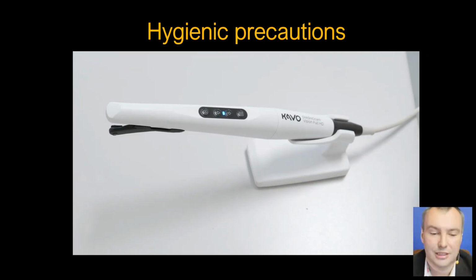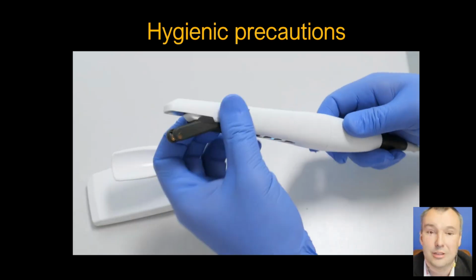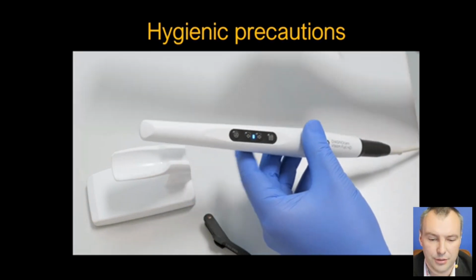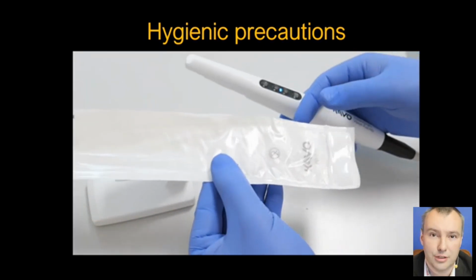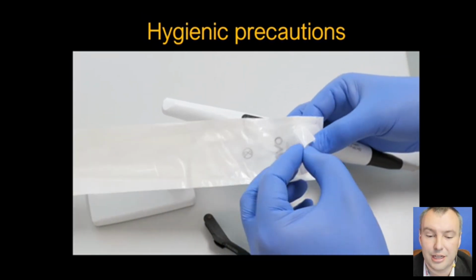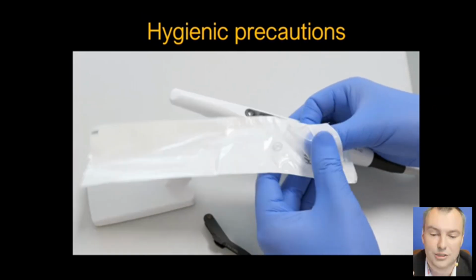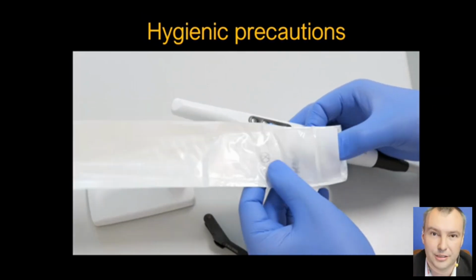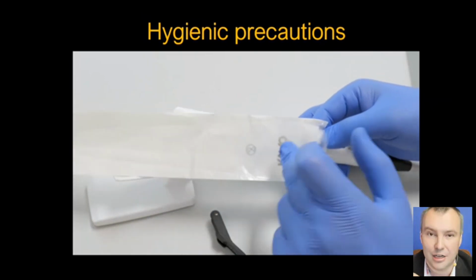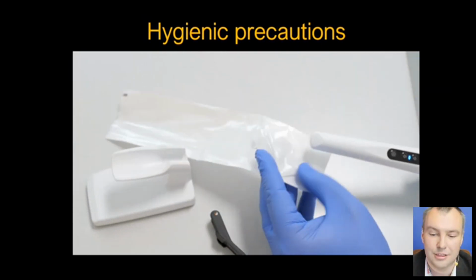So how to start to work with DiagnoCam? First of all, we must take into consideration hygienic precautions. DiagnoCam is a device that will come in contact with the fluids in the mouth of the patient. So we should cover it with a plastic sheath. This plastic bag actually has two different sides. As you can see, one is not transparent and the other, from the inside, is transparent. So we always need to put DiagnoCam inside in the same manner.